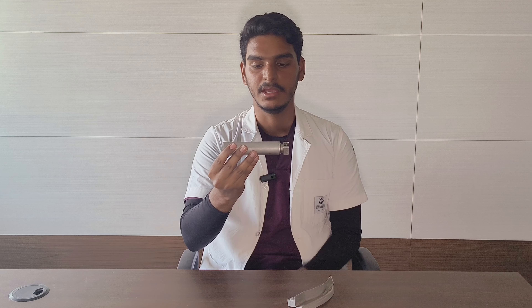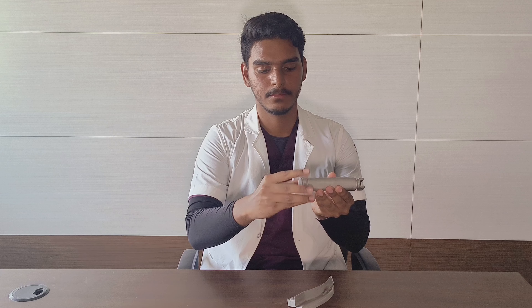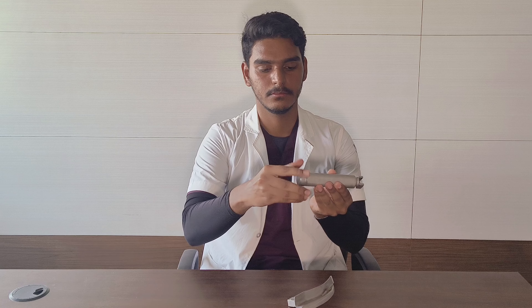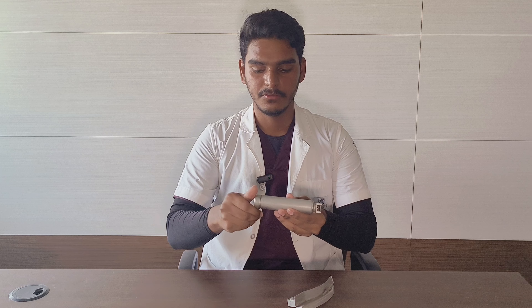The straight blade is called Miller's blade. So now I am going to demonstrate the parts of the laryngoscope. This is the handle of the laryngoscope. Inside the handle, we have a lithium battery, as you can see — this is the lithium battery inside, which acts as the power source. And this is the handle of the laryngoscope.